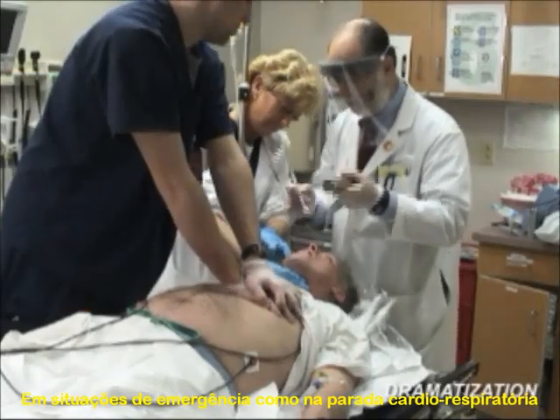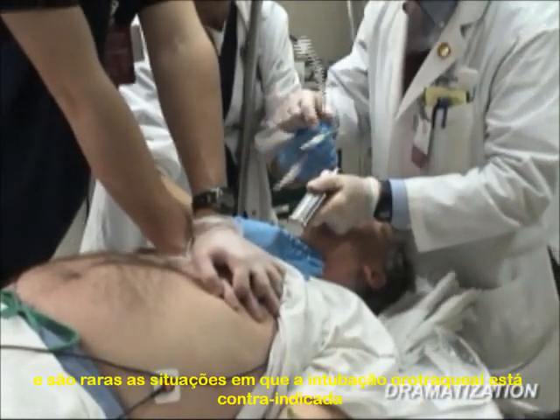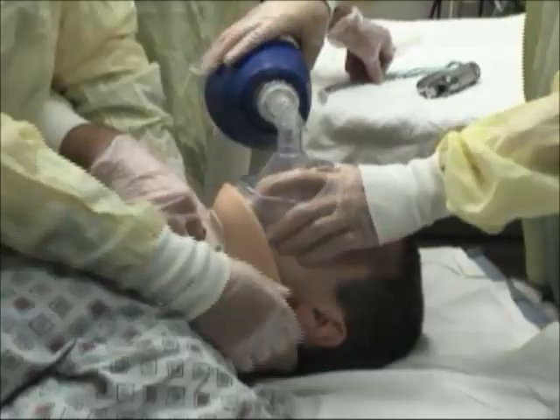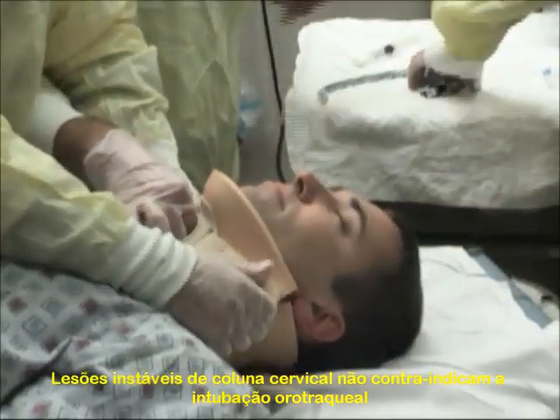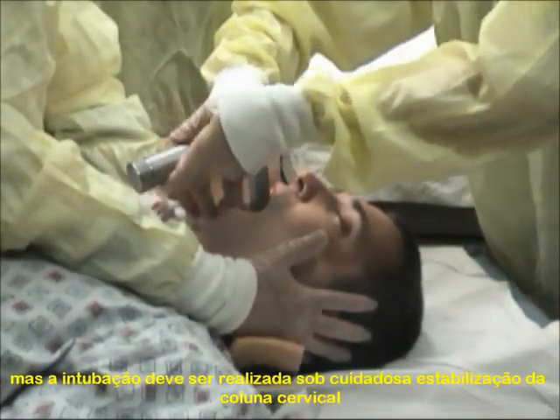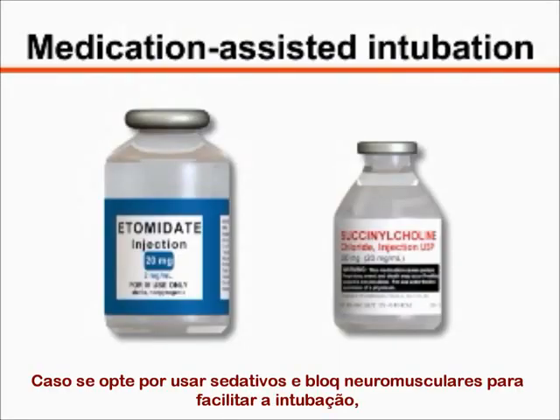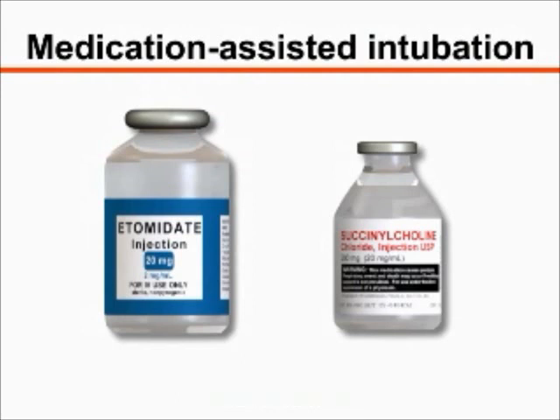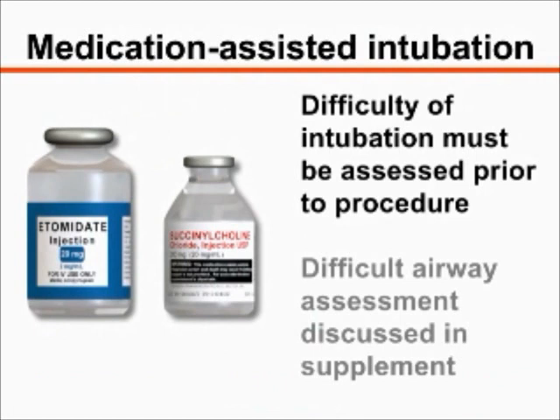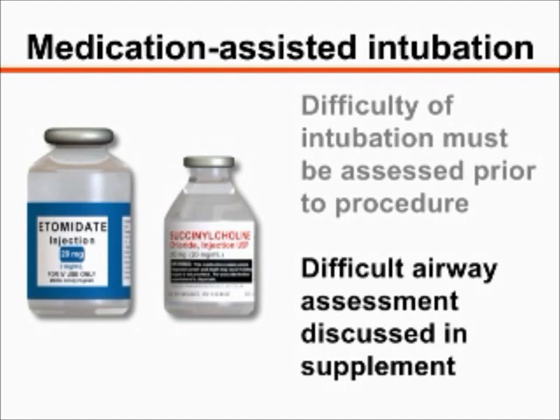In emergent cases, such as cardiac arrest, airway management is of paramount importance and there are very few contraindications to orotracheal intubation. Unstable cervical spine injury is not a contraindication, but intubation must be performed with strict in-line stabilization of the cervical spine. If neuromuscular blocking agents or sedatives are used to facilitate intubation, the difficulty of intubation must be assessed and planned for before proceeding. This assessment is discussed in more detail in the accompanying written supplement.